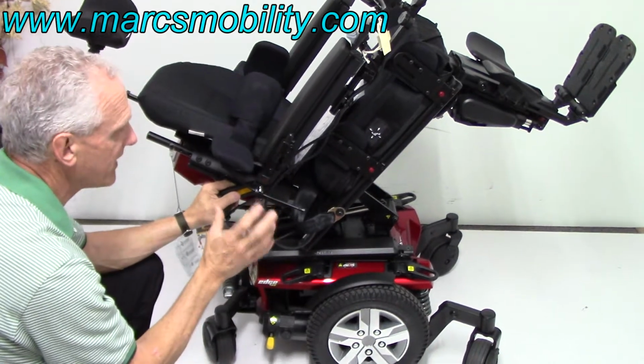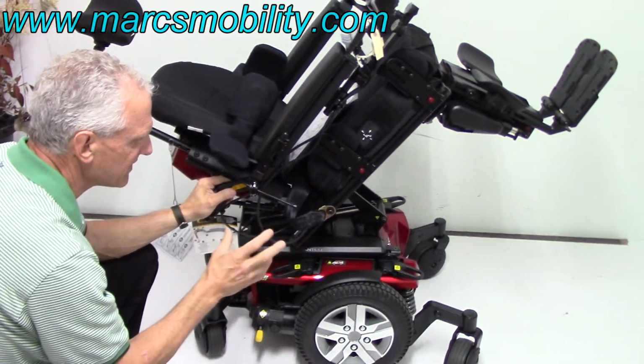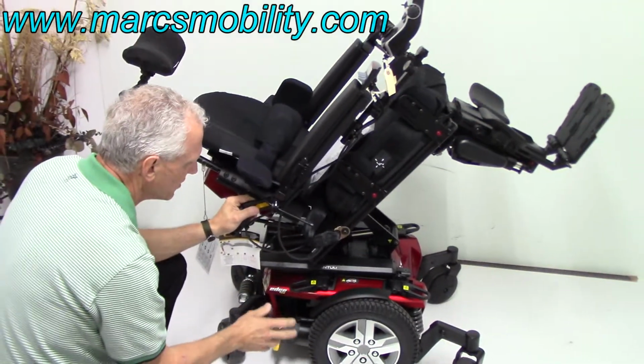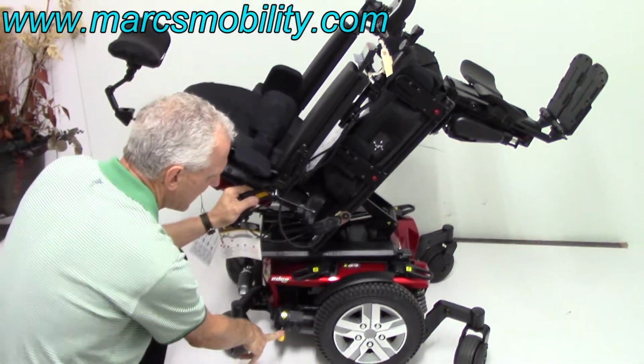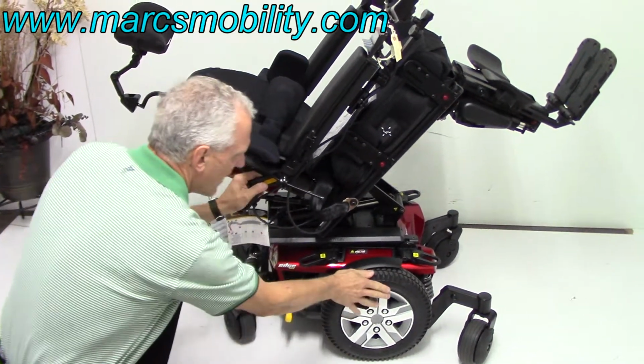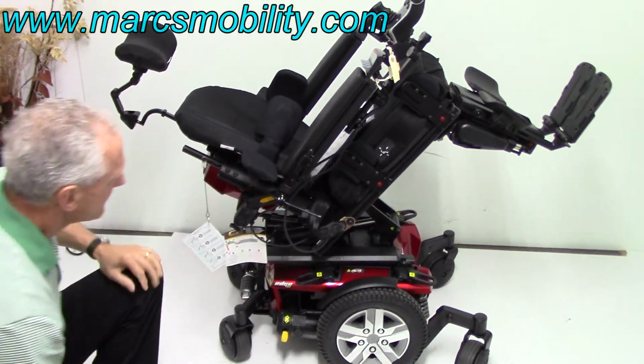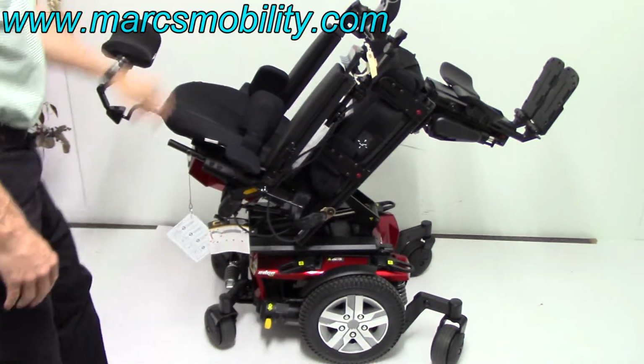Now this chair here weighs about 350 pounds, so it's not like it's a lightweight to push. That's 350 pounds with no person in it. But you would be able to push it if you put it in neutral on both sides. But always remember to put it back in gear when you want to drive, because you're not going to be able to drive if you're not back in gear. So that's that right there. And that's your full electric tilt right there.